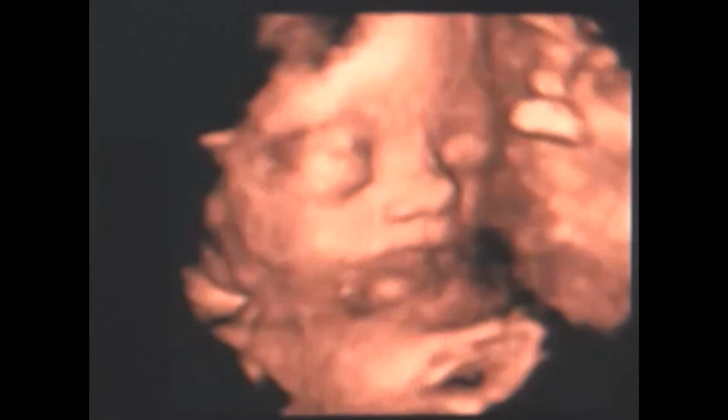And you can see how squished she is. You can see her thighs all the way up to her chest. A lot of times we can't get a lot of chest and legs like that because they're so spread out. She's not, because she's so close we can see everything. That's cool. That looks like an eyeball. I know. Looks kind of weird. And then this is the toe coming in right here. I'll definitely point it out if she opens her eyes. Just kind of see her for it.